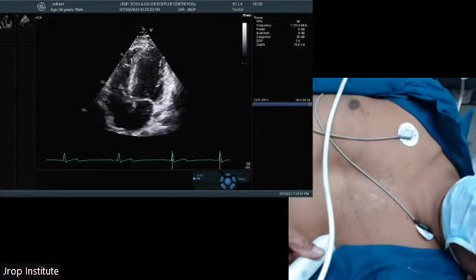Then if I happen to see the papillary muscle, these are the 6 segments of the mid segments. And if I stop seeing the papillary muscle, they are the 4 segments of the apex. Right? Yes, sir. Thank you. It's a very simple thing: mitral valve, basal segments; papillary muscle, mid segments; apex, apical segments.